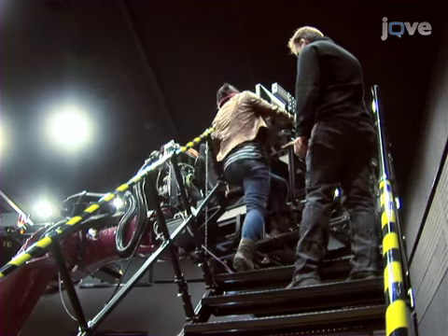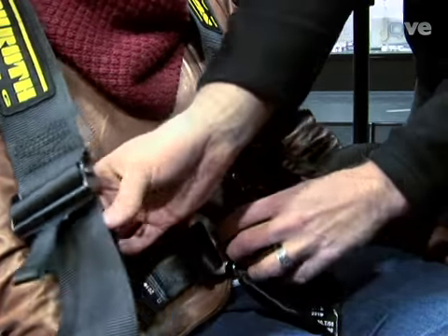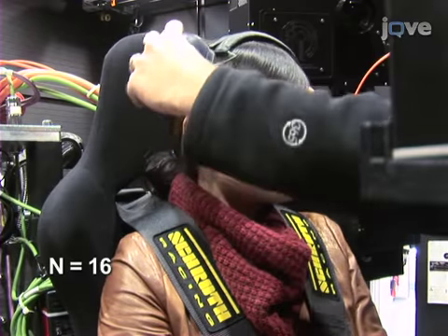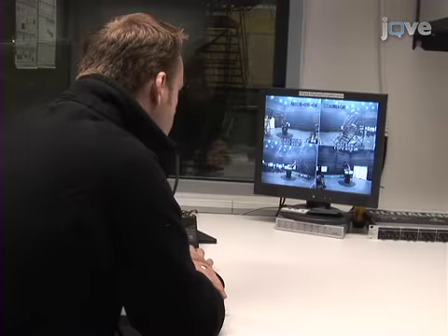On the robot, a race car seat equipped with a 5-point safety belt system is attached to a chassis, which includes a footrest. The chassis is mounted to the flange of the robot arm. Participants must wear noise-canceling headphones equipped with a microphone for two-way communication with the experimenter. They should also be naive to the experimental setup.